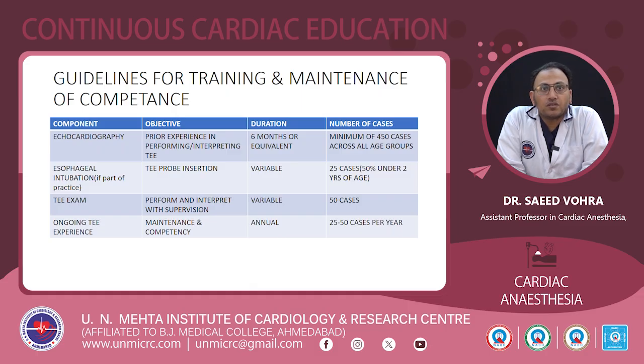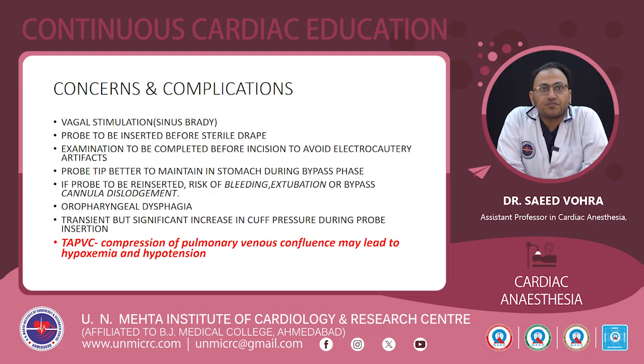For esophageal intubation, the TE probe insertion, the objective is TE probe insertion, duration is variable, and minimum of 25 cases or 50% under 2 years of age. For TE exam, the objective is to perform and interpret with supervision, duration variable, and number of cases is minimum of 50 cases. And ongoing TE experience to maintain the competency, duration is annual, and number of cases to be 25 to 50 cases per year.